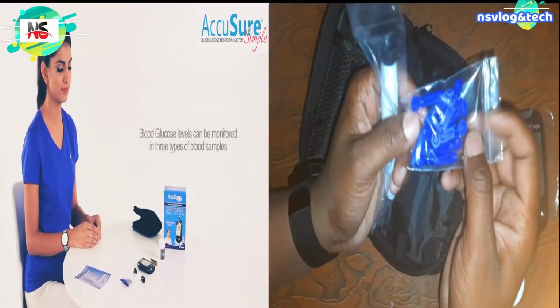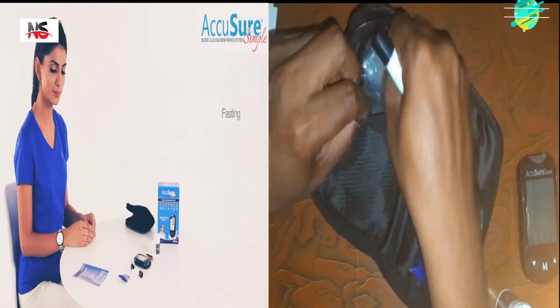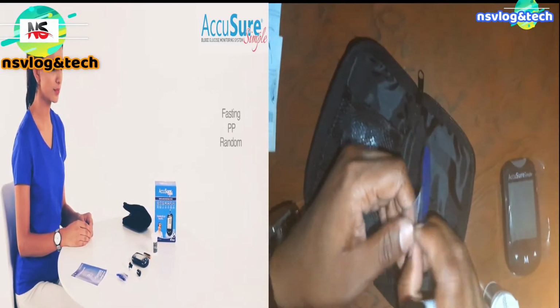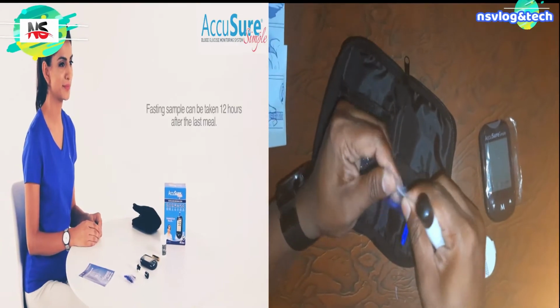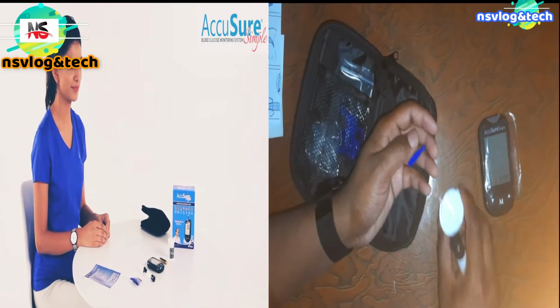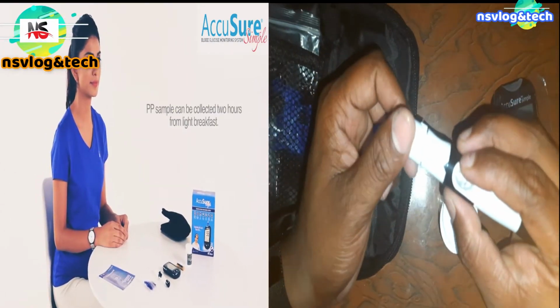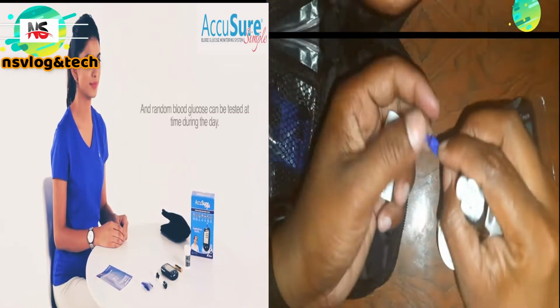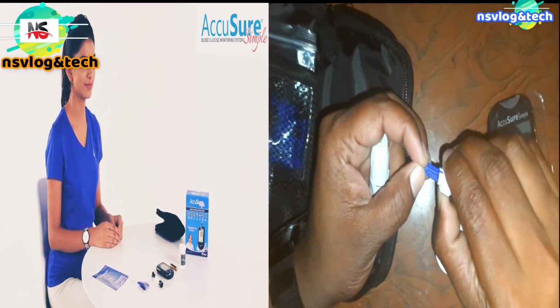Blood glucose levels can be monitored in 3 types of blood samples: fasting, PP, and random. Fasting sample can be taken 12 hours after the last meal. PP sample can be collected 2 hours from light breakfast. And random blood glucose can be tested at any time during the day.